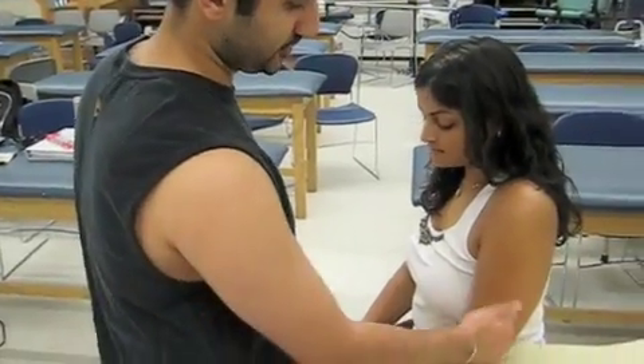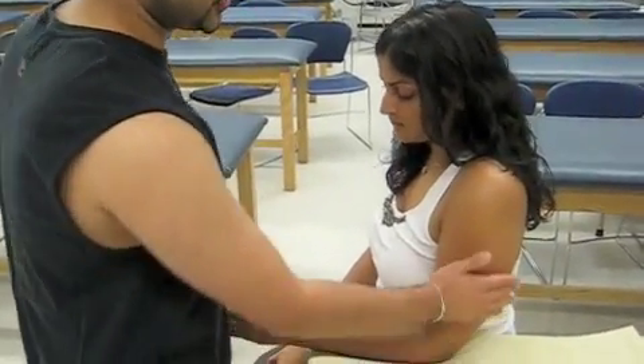Hi, my name is Lev, and today we're going to measure pronation and supination of the forearm. Deepo's going to be my patient. She's going to be sitting with her hand off the plinth. Her elbow is going to be flexed 90 degrees, and the humerus is going to be close to her body.